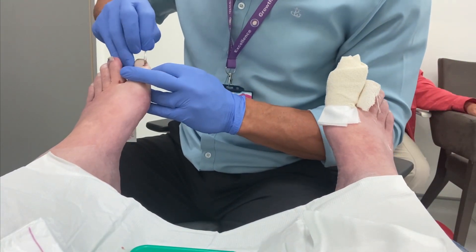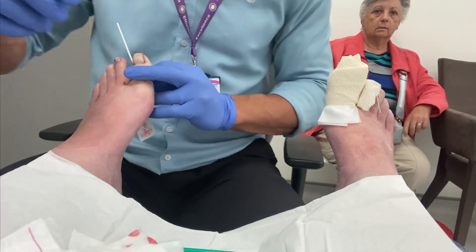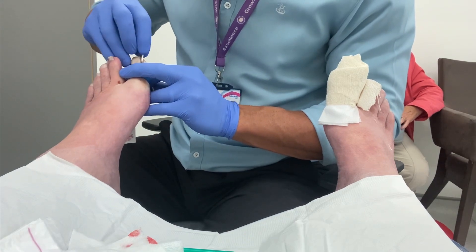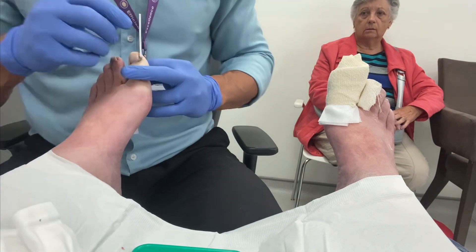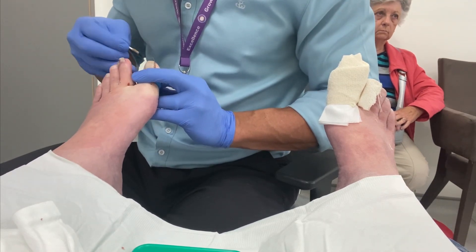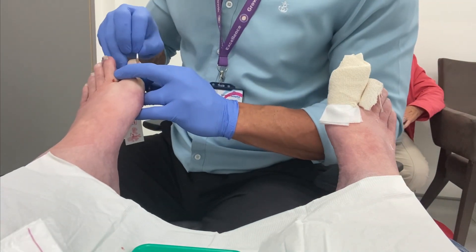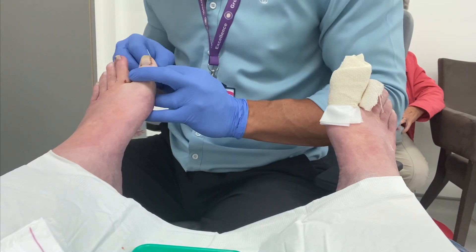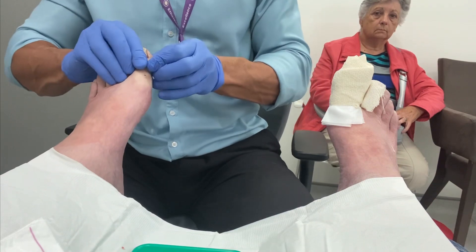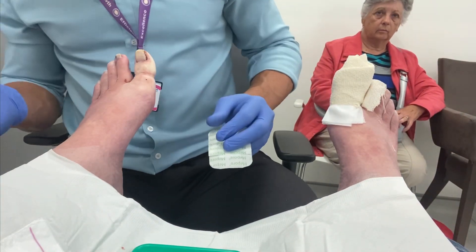I'll just straighten up the nail edge with a scalpel and we begin phenolizing this nail also. We're always careful to remove any overspill of phenol on the surrounding tissues. Phenol is very acidic and will easily burn the surrounding skin and tissues, and can burn the nail plate if not removed quickly. It's important with all patients to minimise damage to the surrounding tissues, but especially in those with systemic complaints like diabetes.